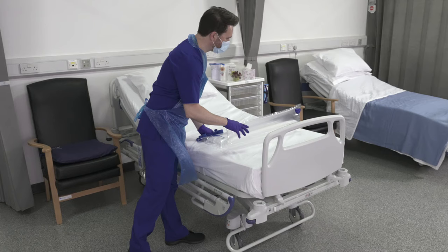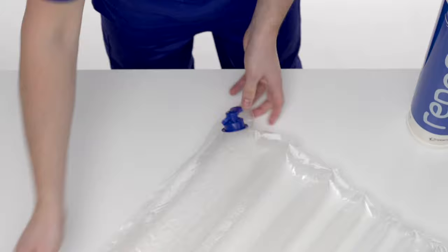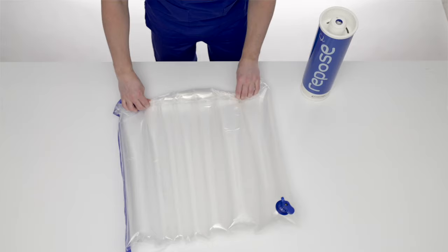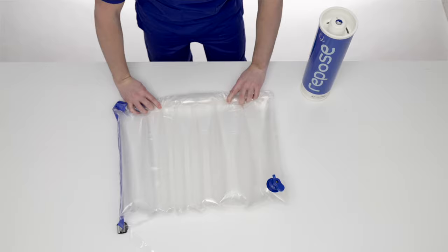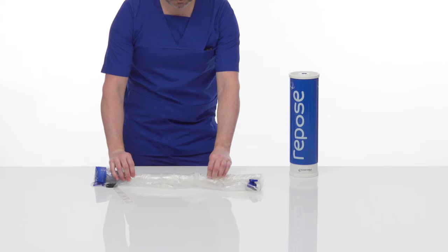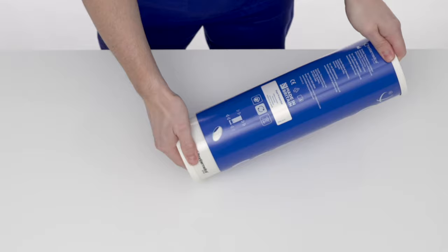With the patient off ReposeFlex, detach from the mattress. Insert the open end of the sealing cap into the Repose valve, allowing air to escape. Once deflated, with the cap still in place, roll up Repose starting at the point furthest away from the valve, expelling any remaining air. Repeat this process as necessary. Fold and roll up and place inside the pump for safe storage, then rotate the outer tube until it clicks closed.